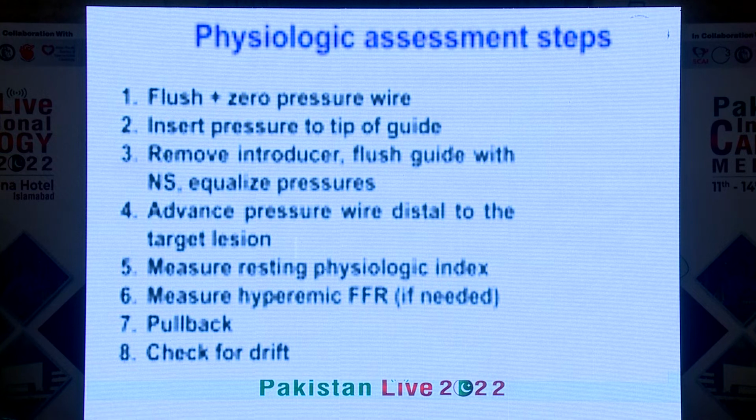So a reminder again of these steps. Flush and zero the pressure wire. Insert pressure wire to the tip of the guide. Remove the introducer. Remember to remove it. A lot of people forget it and then need to do it again. So flush the guide with normal saline. Equalize pressures. Advance the pressure wire distal to the target lesion.